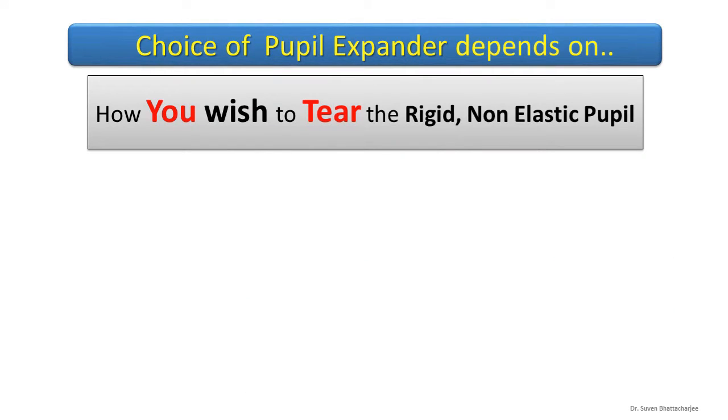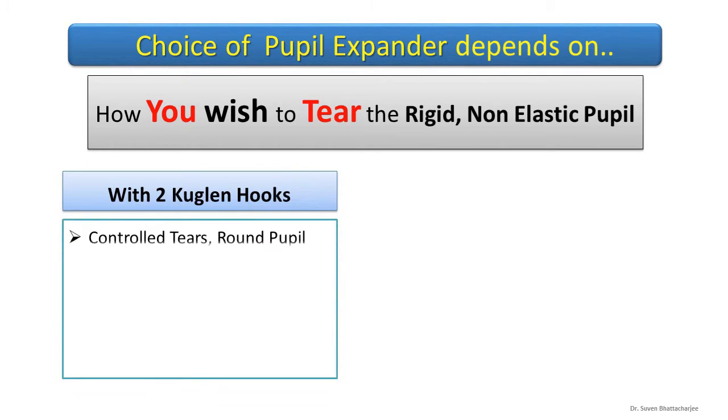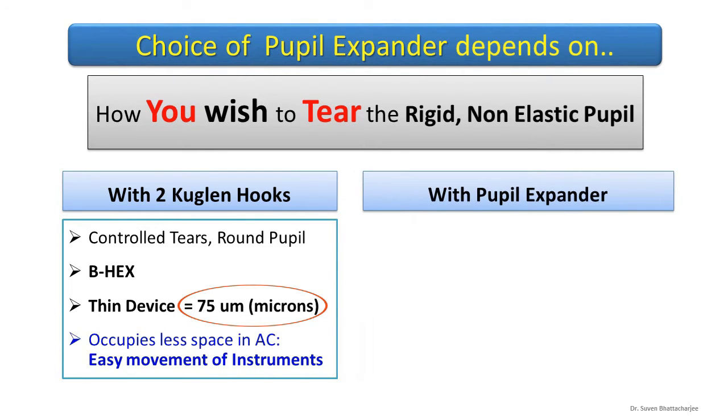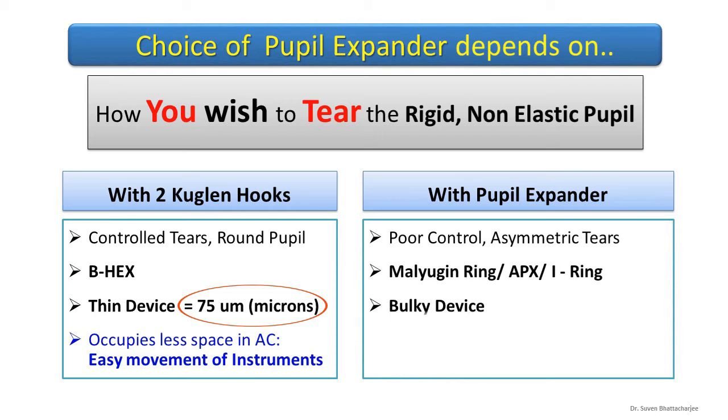The choice depends on how you wish to tear the rigid pupil. With two Kuglin hooks, the hair-thin BHEX allows a lot of space in the AC for instruments. To tear with the pupil expander it has to be bulky, and that would obstruct instruments.